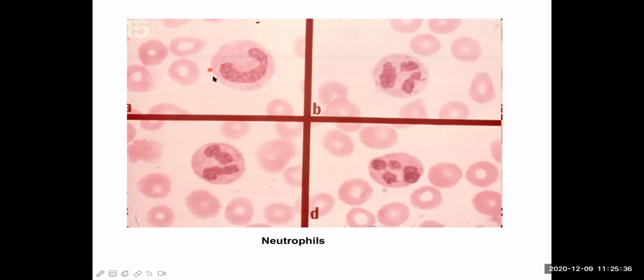This is the most immature form of the neutrophil, and this is seen in peripheral smear in severe acute bacterial infection. I can give you many different examples here, like acute pyogenic meningitis, acute bacillary dysentery, acute pyelonephritis, acute osteomyelitis, acute lobar pneumonia. So any type of infection example you can give here. These are different other stages of the neutrophil. This is becoming mature now. See this? This is a mature neutrophil.